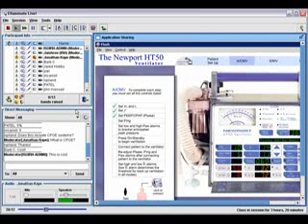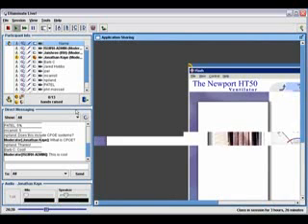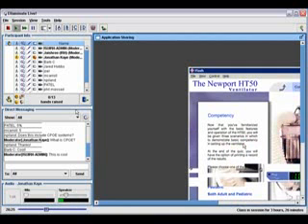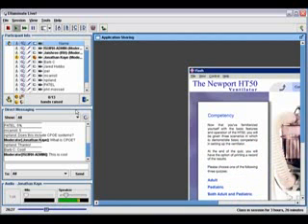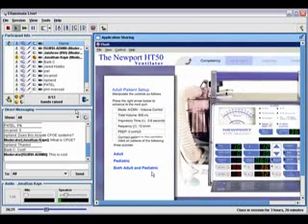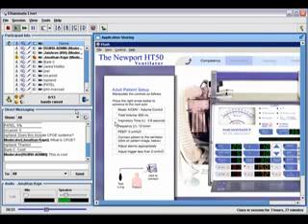Once they've achieved this level and the instructor wants to give them a quiz, or they want to do a little mini operational proficiency on their own, what they call the demonstrate basic competency, then they go into one of a number of different scenarios where they don't get the check marks, but they're given the order, and they have to set the tidal volume to 600 milliliters, which will actually be in volume control mode.